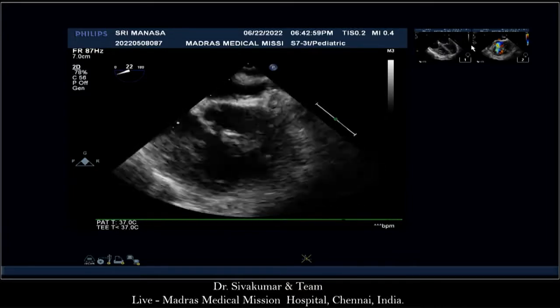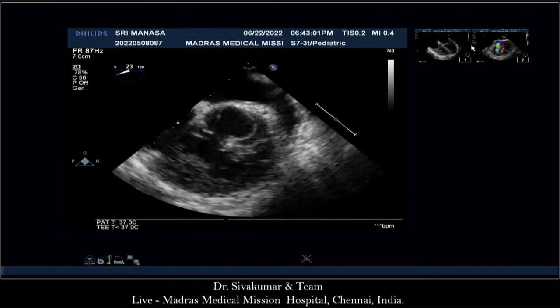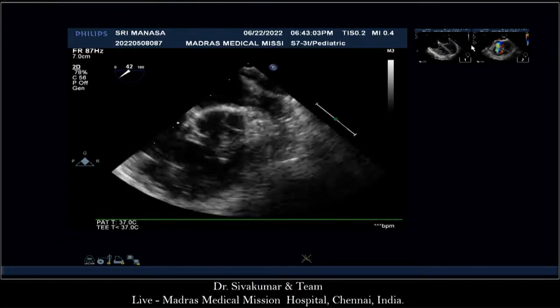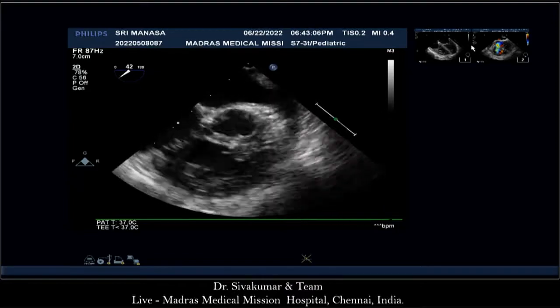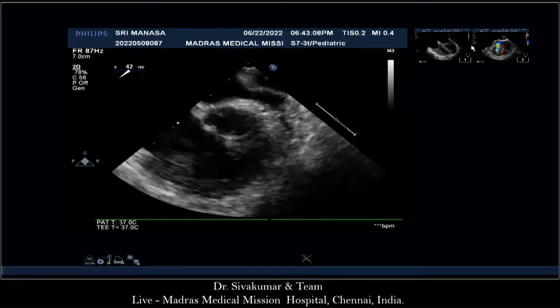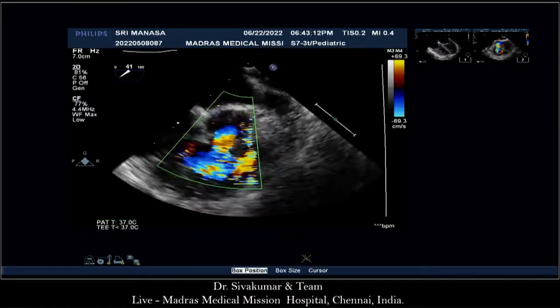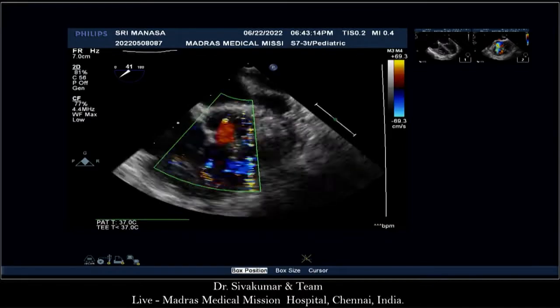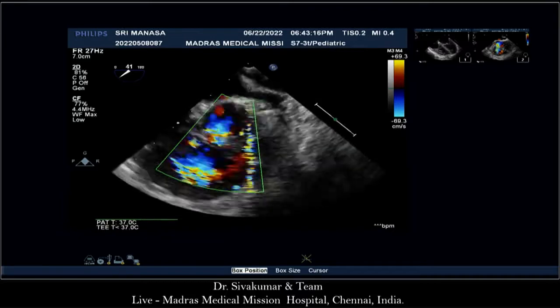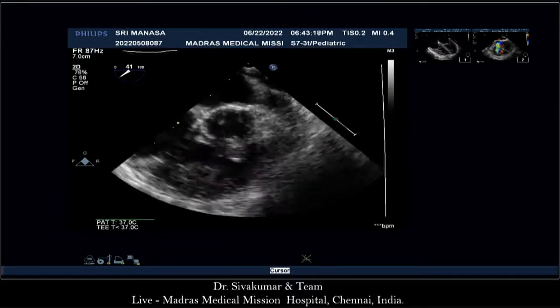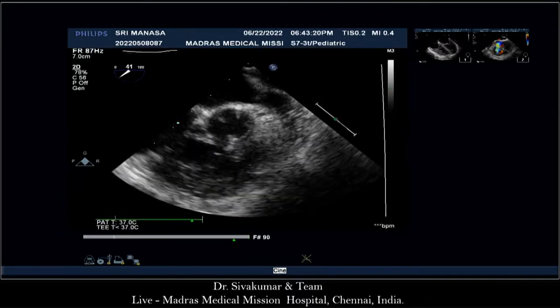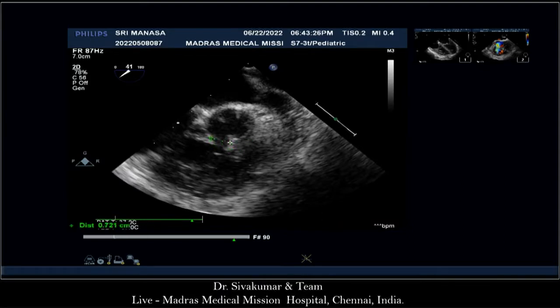On live echo, we can see the VSD in a short-axis view. The VSD is closely located beneath the RCC-NCC commissure. After adding color, the maximum size measures around 7 to 8 millimeters.